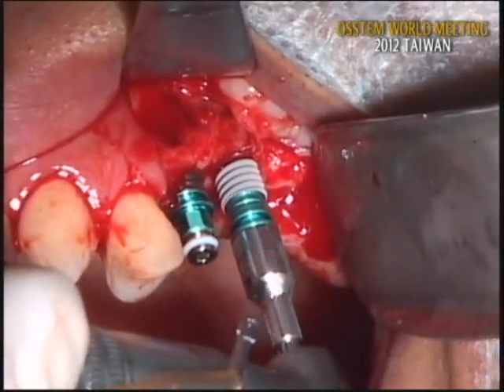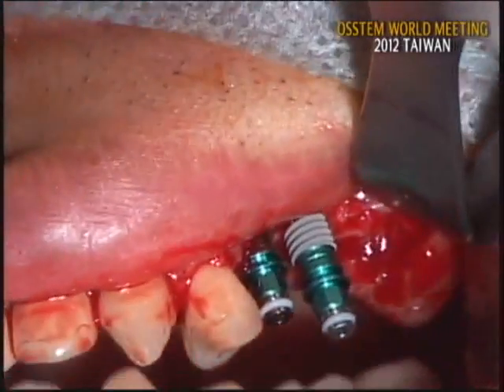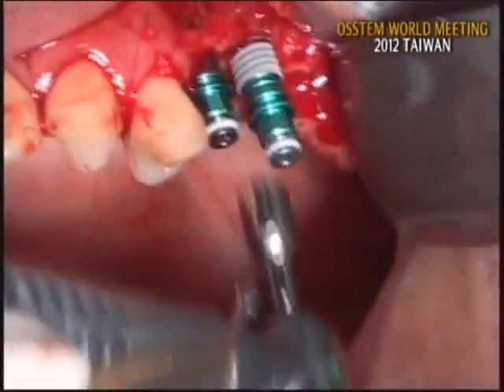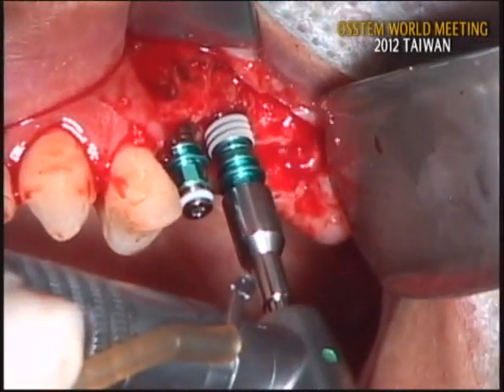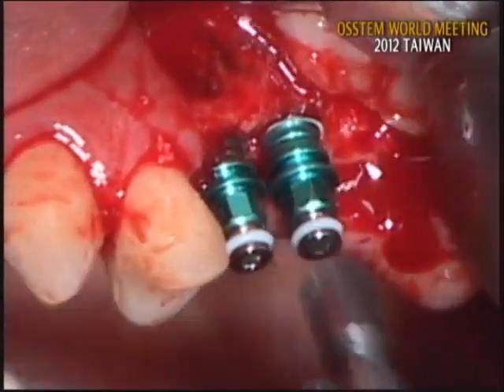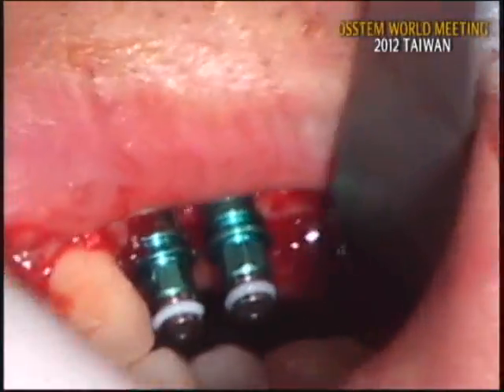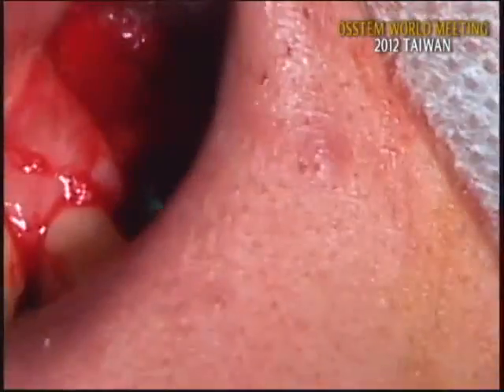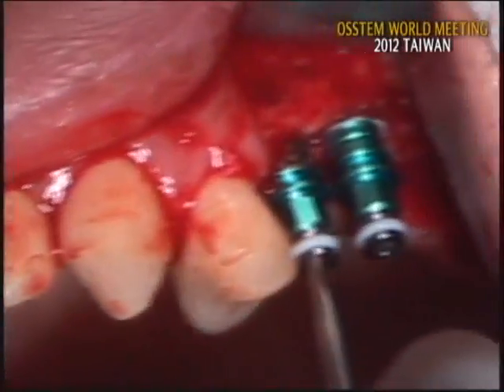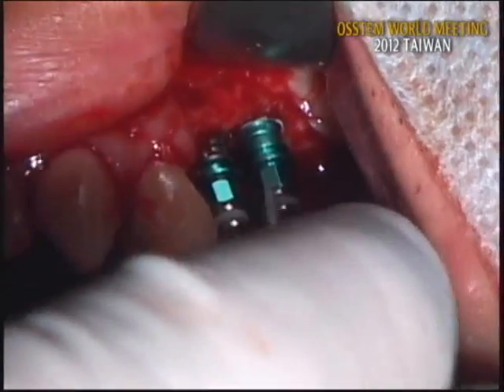Do not insert the full depth and check the path first. Close, light close is good. Open, please. Then finish. And do not make a full depth installation. Close, please. Looks very nice. Open, please. Then remove the mount.